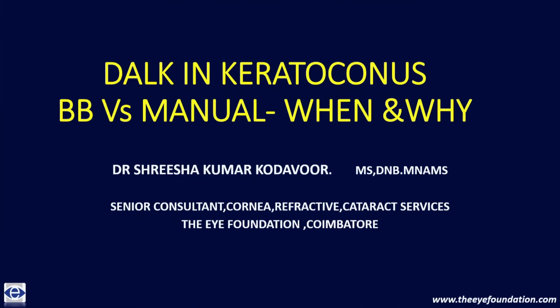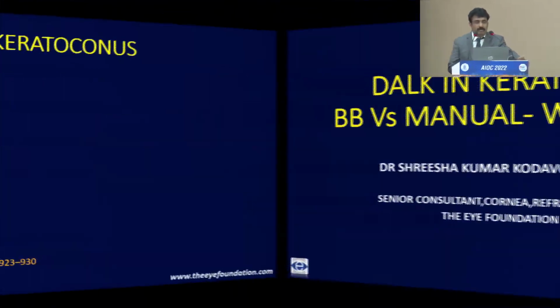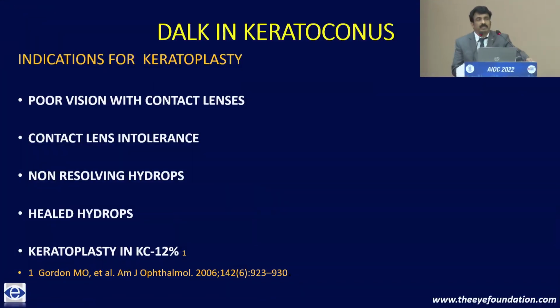And so my topic is DALK in keratoconus: big bubble versus manual, when and why. So we all know the surgical management of keratoconus has changed, and we have success in DALK. In most of the cases now, DALK has become an automatic choice for the management of keratoconus. It has replaced penetrating keratoplasty in most of the cases which require keratoplasty.